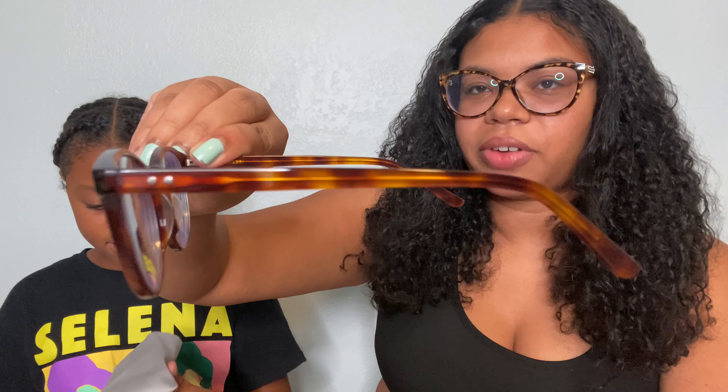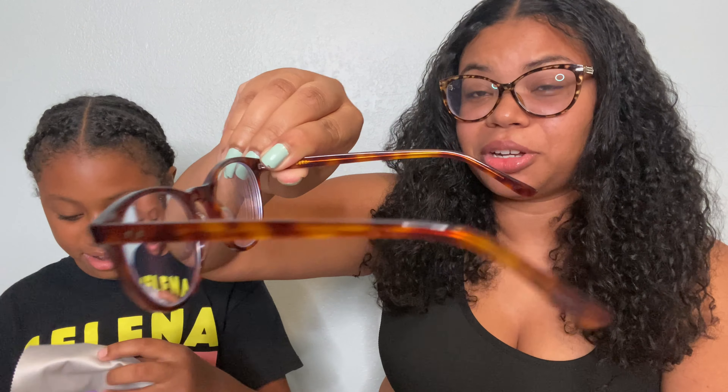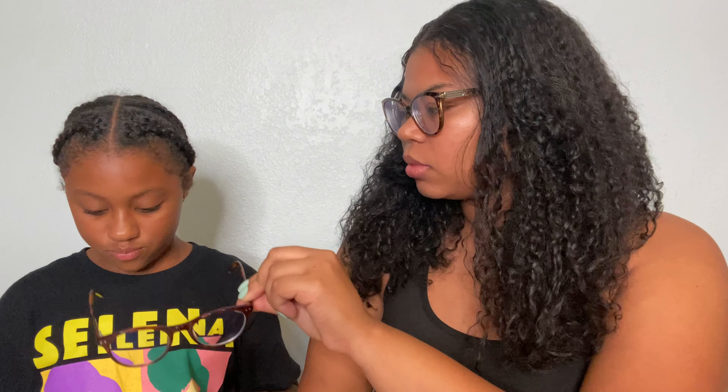You have to pull your hair up so they can see. Inside the box there is a card for returns, and information on how to adjust your glasses, cleaning, and all of that. So these are her new frames — you can go ahead and switch them out. We both have prescription glasses, which are actually both kind of strong, but Kenya has the blue light option.